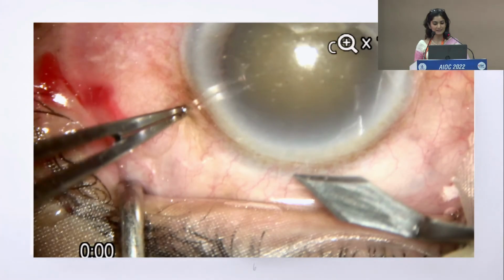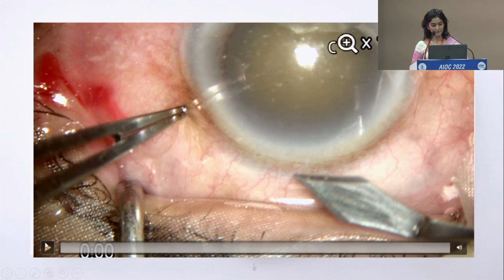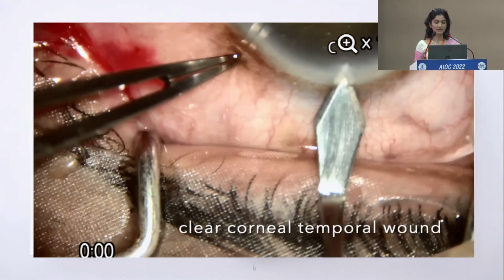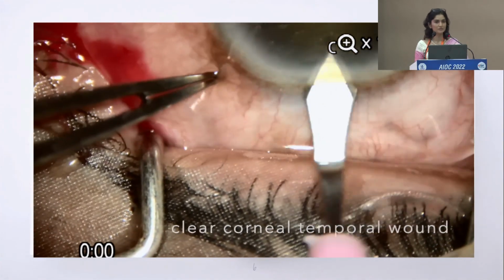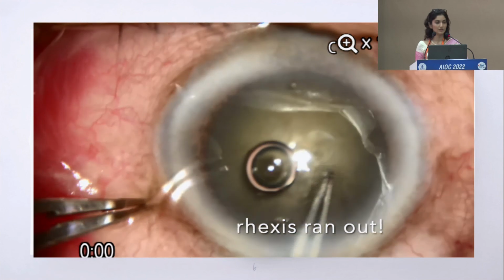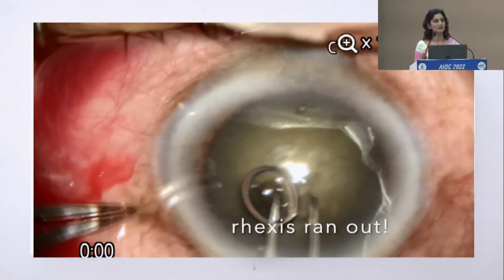The conversion from a phaco to SICS is slightly different in the manner that you make your scleral tunnel, because one has to understand that this is not a closed globe. You've already made multiple side ports, main port entries, so it's more likely to collapse. So a good anterior chamber viscoelastic, a high density viscoelastic, and irrespective of where your incision is, it could be a superior 2.2 or 2.8 incision, you can still make a superior tunnel, or even if you're doing a temporal clear corneal incision, you can still make a superior tunnel.